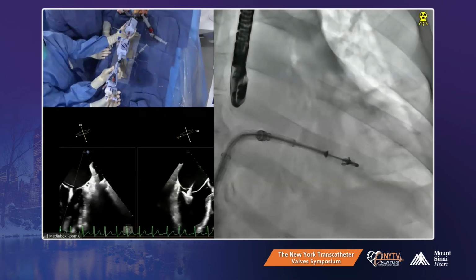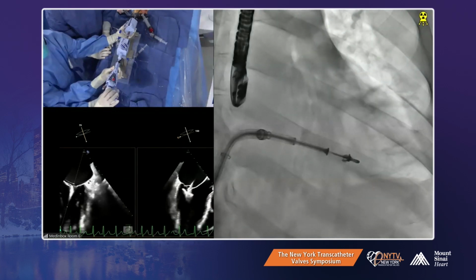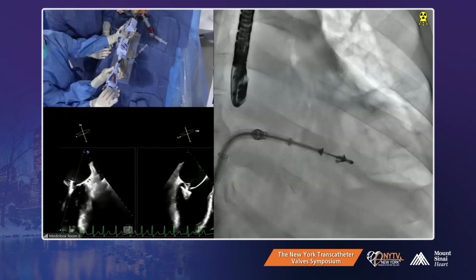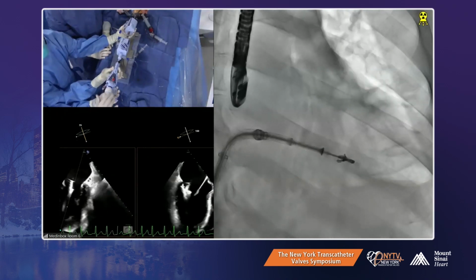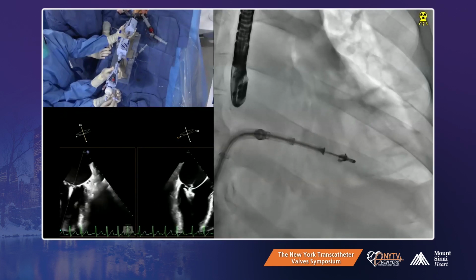Up the posterior. Ready? Close the clip a little bit, especially with the long close device. Close. Close more. Good. Drop posterior. Okay, we're going to drop the posterior, the tactile.